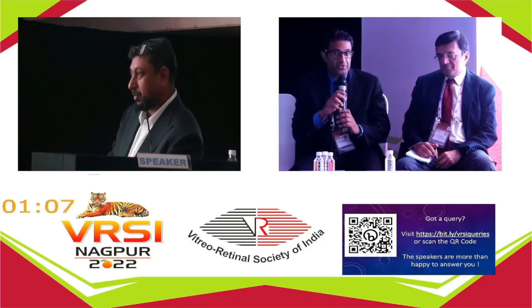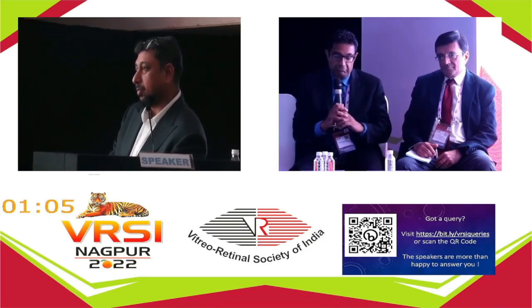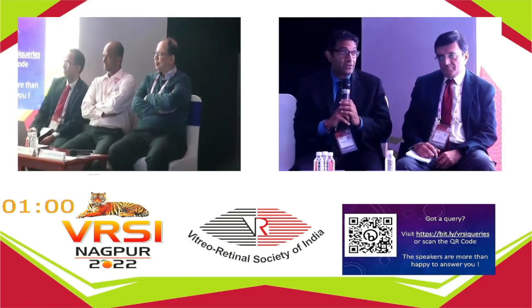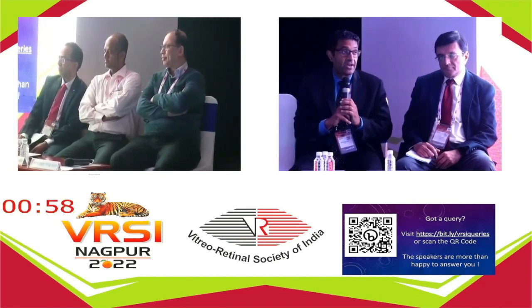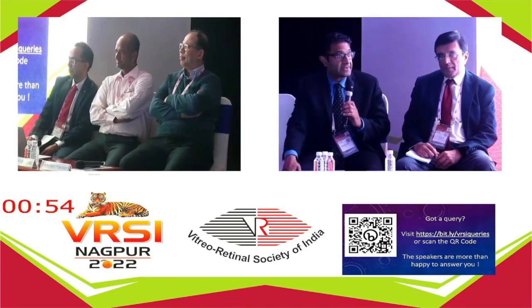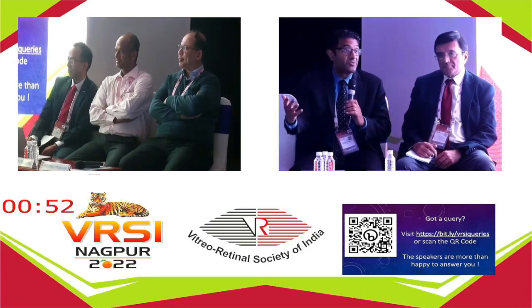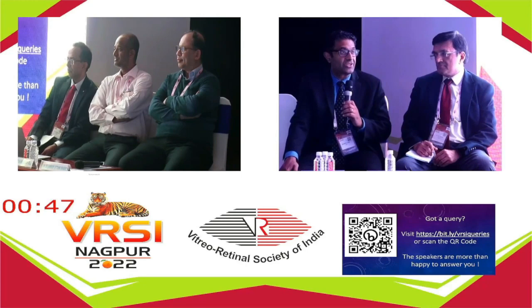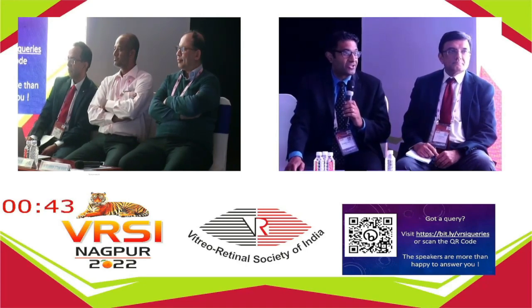We do use the swept source OCT quite regularly. I think you get better visualization, but honestly, for most purposes, spectral domain is just fine. You showed some beautiful images. What I was impressed by with those patterns is just how reliable, or easy, it is to make those grading determinations. We tried to do that.